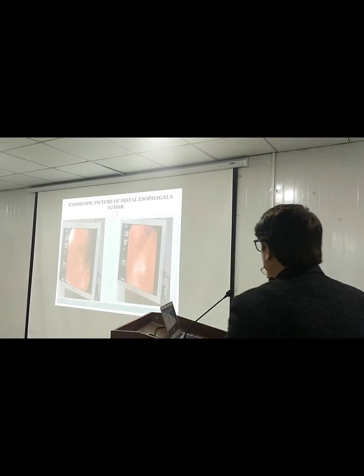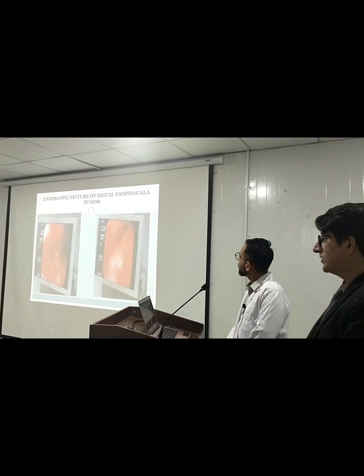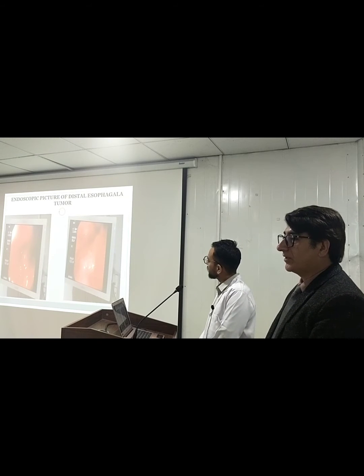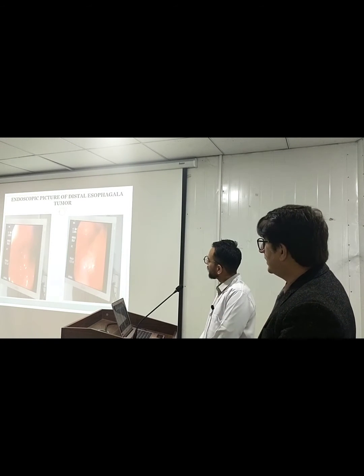Yes, it's the endoscopic picture of a young guy who presented with a massive upper GI bleed. The patient had no previous comorbids, non-smoker and no other addictions. But the patient's history revealed that he took some Hakimi medications for a month, given by his mother for his health. After taking that, the patient landed with upper GI bleed, though a few other pictures were very clear.